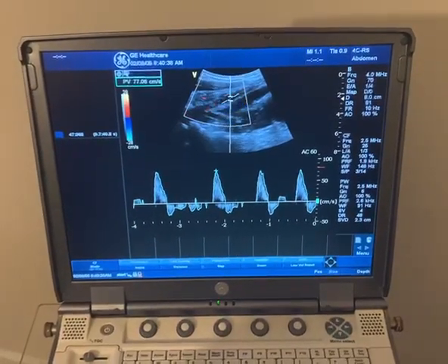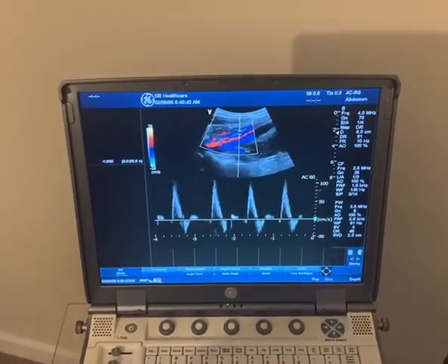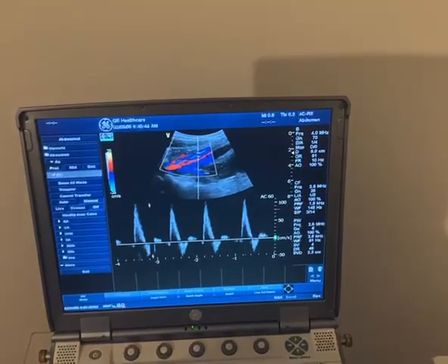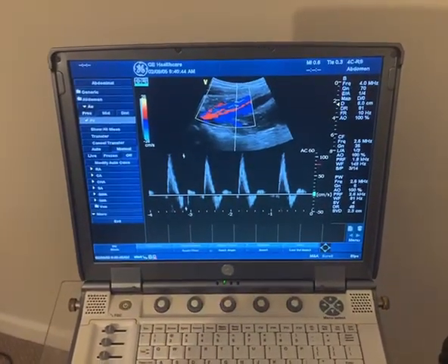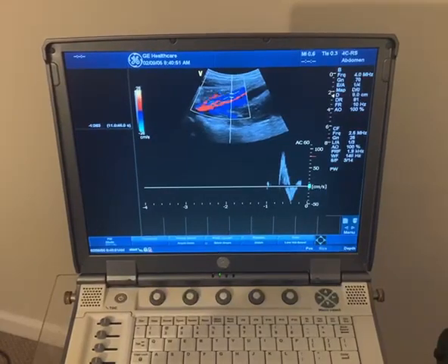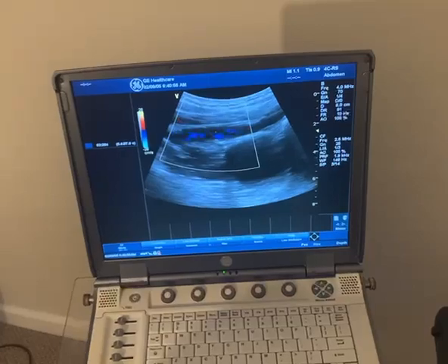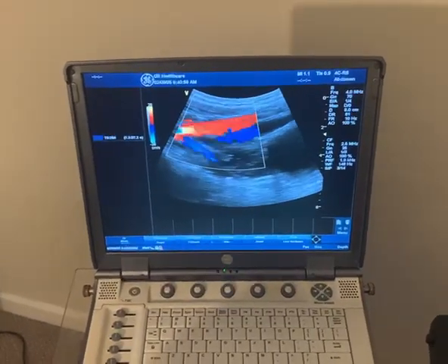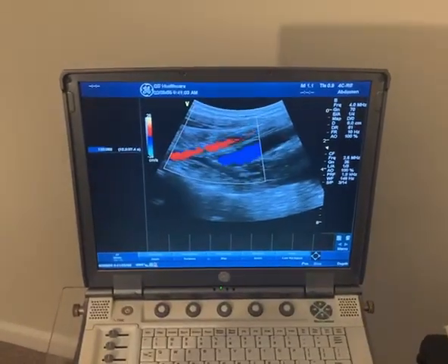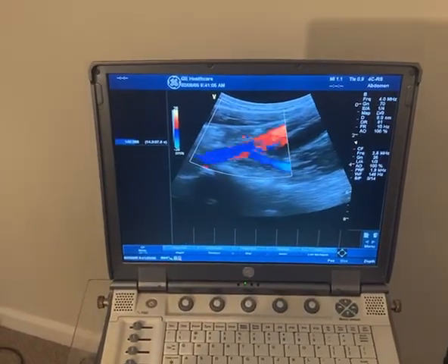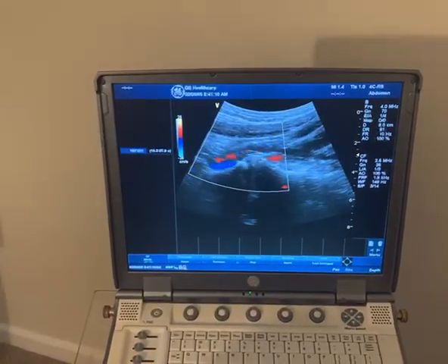As you can see, I'm rocking my probe to improve the angle on my image — improving the angle also means improving the waveform. I can get external iliac artery imaging right on that view. Coming out of pulse, back to the groin external iliac artery and rocking the probe towards the patient's head, I can see the hypogastric artery pulsating, then slowly rock the probe to see my common iliac artery and into the distal aorta.